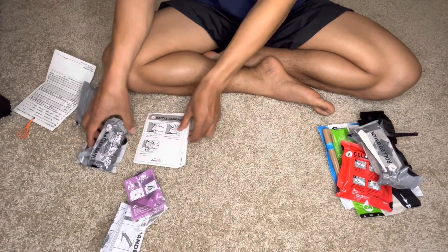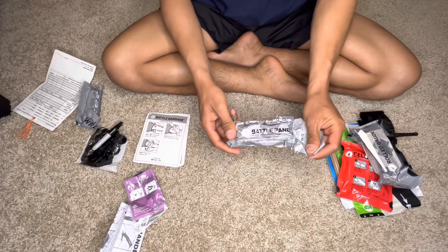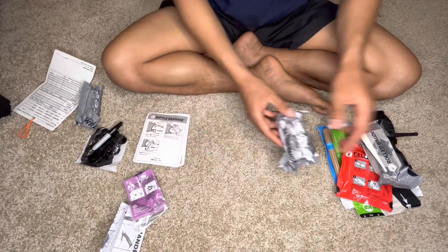The next one will be the battle bandage. Same thing — still sterile. I don't want to contaminate it so I won't open it.